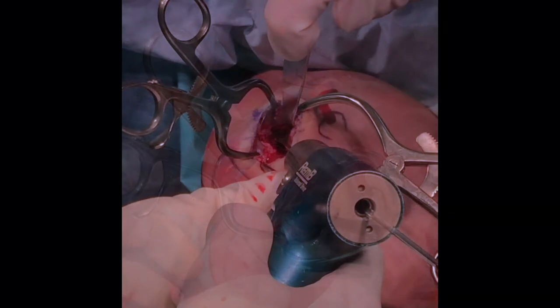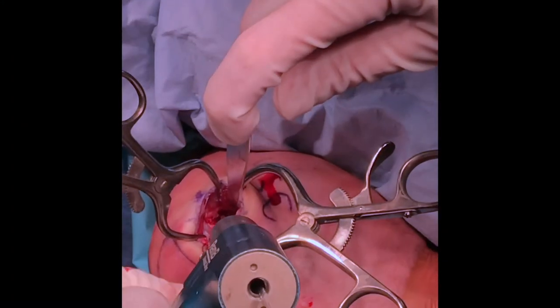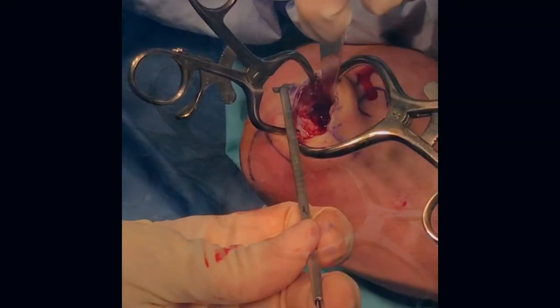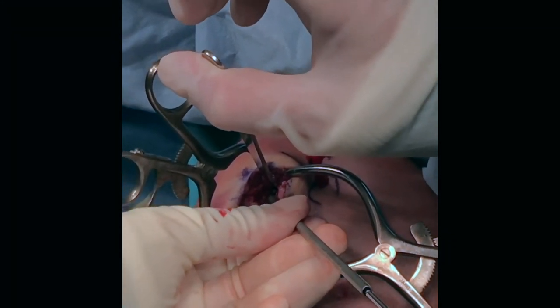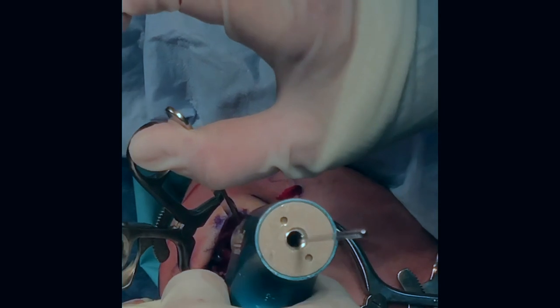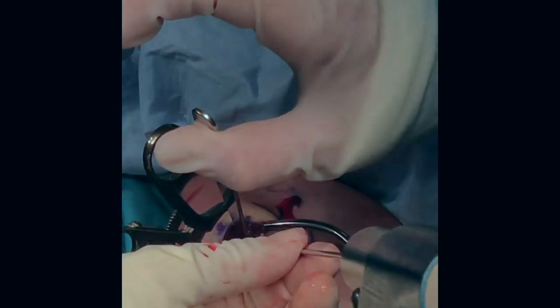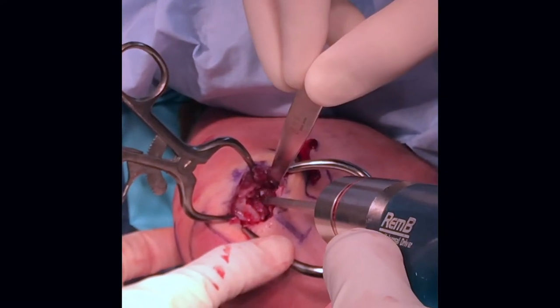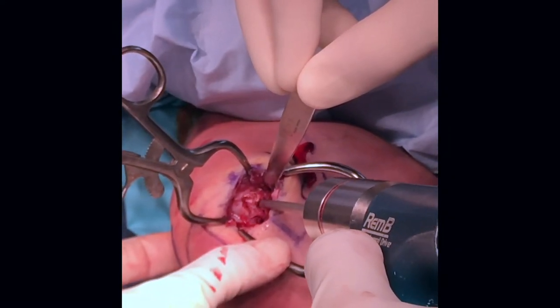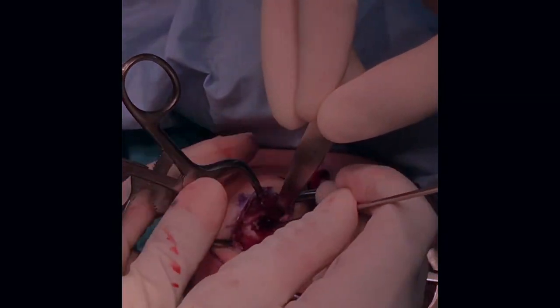The lesion measures approximately one centimeter using sizing guides. A drill is used to create a pilot hole in the exact center of the lesion. A reamer is provisionally positioned over the lesion to assist with placing a pin exactly perpendicular to the lesion, and then a recipient socket is created, approximately 10 to 12 millimeters.